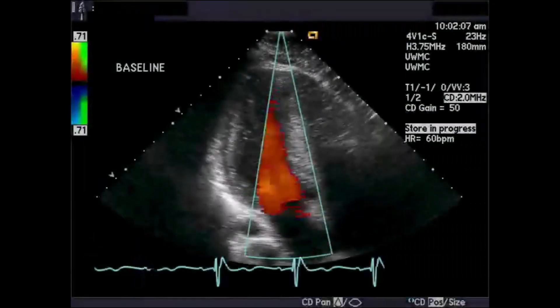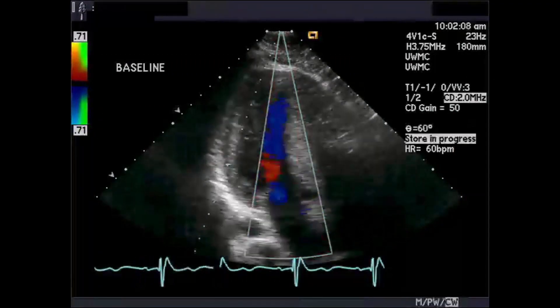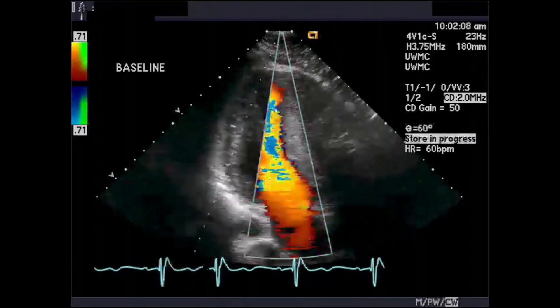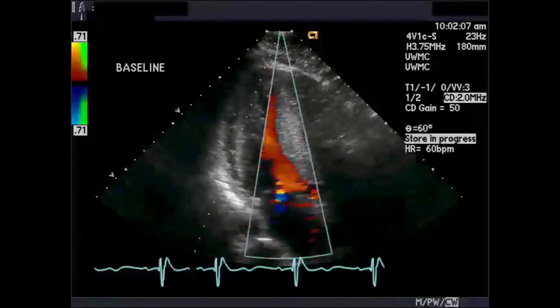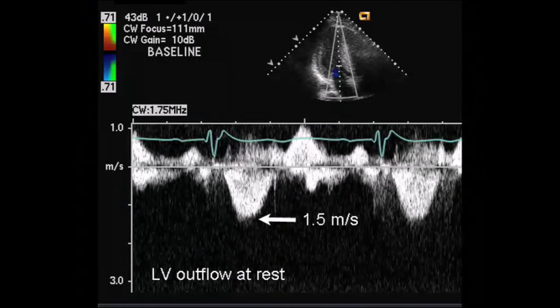At baseline, echocardiographic imaging in an apical long axis view shows hypertrophic cardiomyopathy with normal left ventricular systolic function, color flow evidence of an increase in velocity proximal to the aortic valve, and mild mitral regurgitation. Continuous wave Doppler shows only mild subaortic obstruction at rest with a peak velocity of 1.5 meters per second.